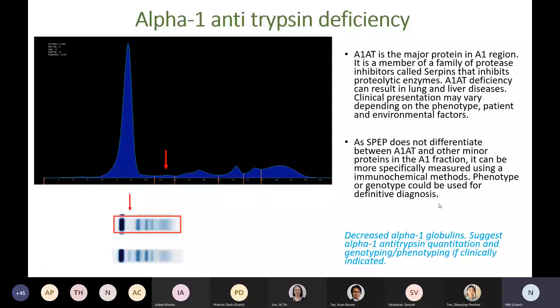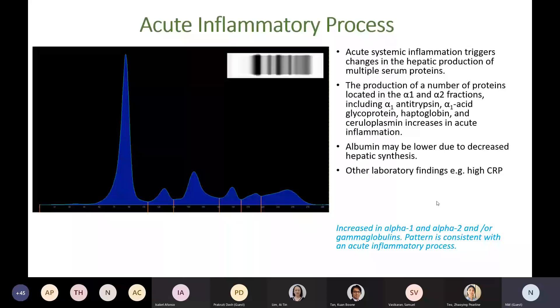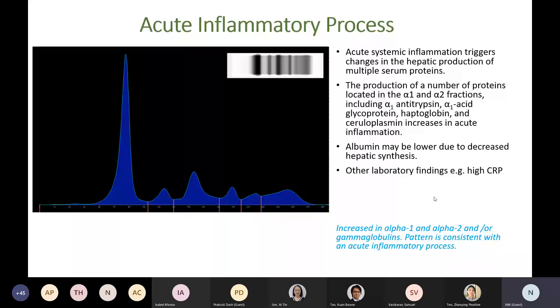A serum protein electrophoresis pattern showing acute phase reaction is not uncommon, especially in hospital patients. Acute systemic inflammation triggers changes in hepatic production of multiple serum proteins. The production of proteins located in the alpha-1 and alpha-2 fractions — including alpha-1 antitrypsin, alpha-1 acid glycoprotein, and haptoglobin — can increase during acute inflammation. You may find other relevant laboratory findings such as high CRP levels. It is useful to state acute phase reaction in the report. If querying any underlying monoclonal protein, you could either do immunofixation or suggest repeating serum protein electrophoresis when the acute phase has resolved.